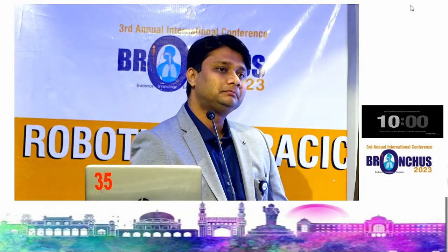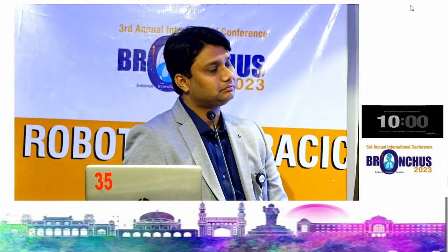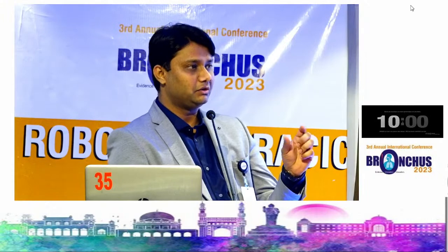Holding the lung, generally what we do is hold it with sponge forceps, and in robotic surgery I have seen puncturing of the lung. That is another question I wanted to ask. Of course, we don't have any experience with robotic, but there was a comment that don't underestimate the power of the robotic arm. Yes. So does it matter, especially for the lung?